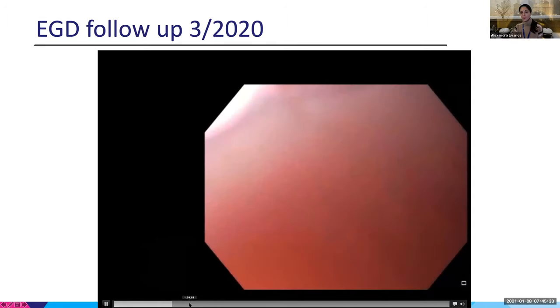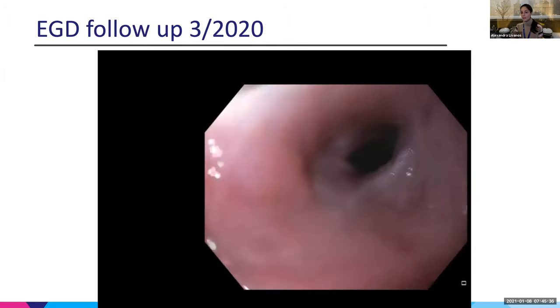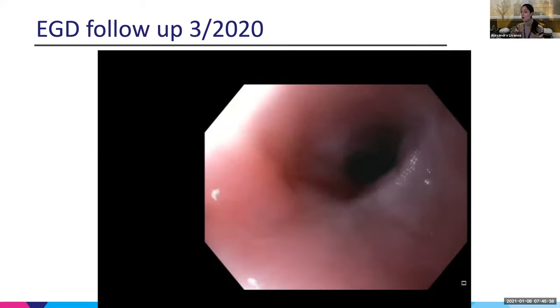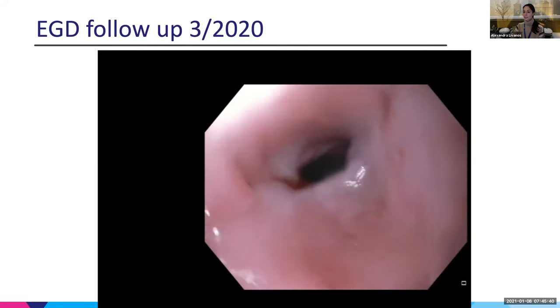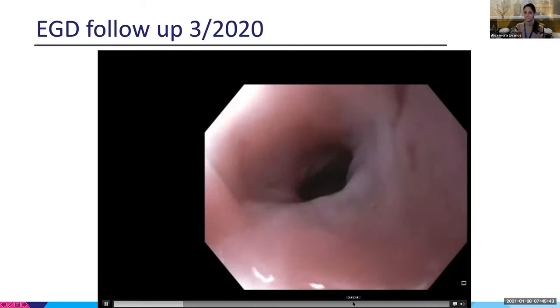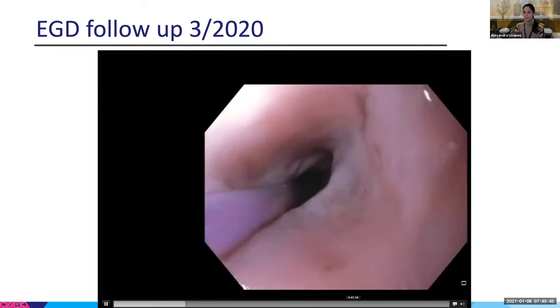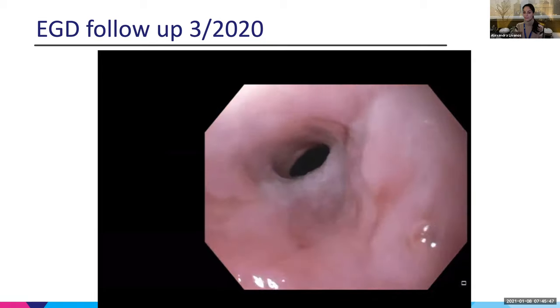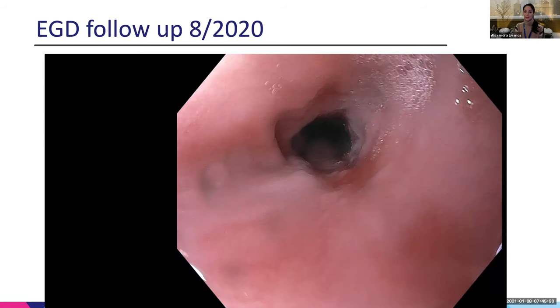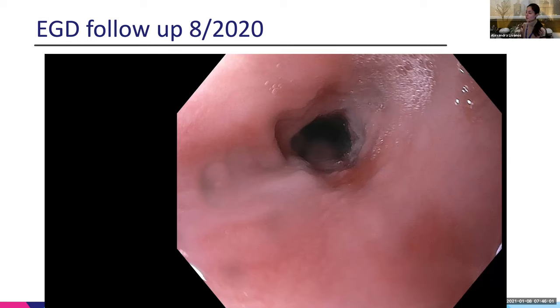Once it's dilated, he's able to pass it and get into the stomach, and you can see all the ulceration is healed, which is great. She also got scoped again in August, and you can see the mucosa looks great compared to what it looked like before. She's doing really well. We took repeat biopsies and they've all been negative.